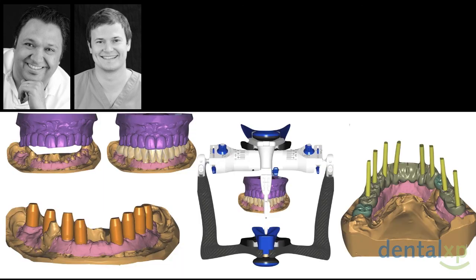We tried to keep as digital as possible. To be very honest, today digital impression for full arch restoration doesn't work very well. We have tried it many times and we're really not satisfied by the accuracy of the procedure. But once we take a conventional impression with plaster in this case, and silicone too for the two remaining teeth, we switch once again directly into the digital world.